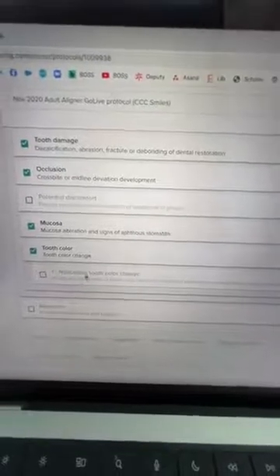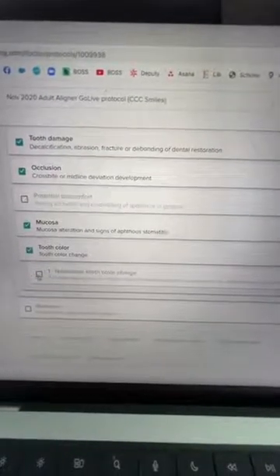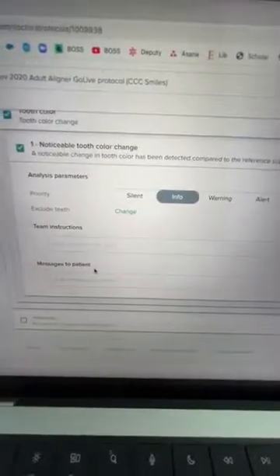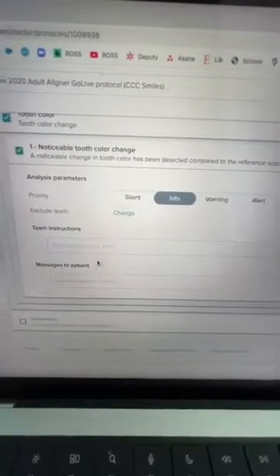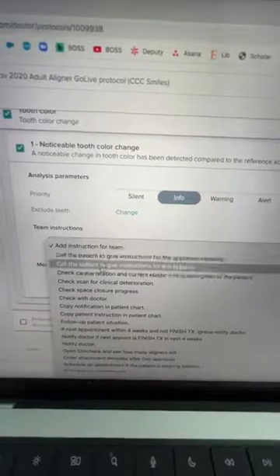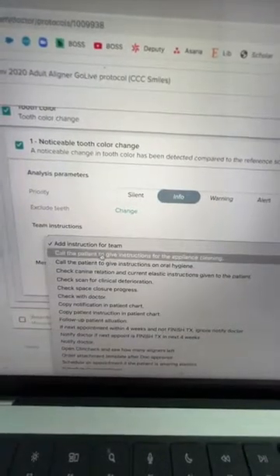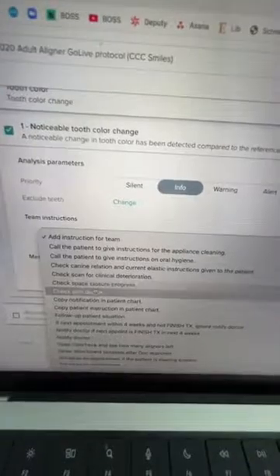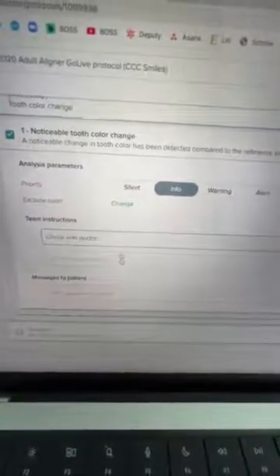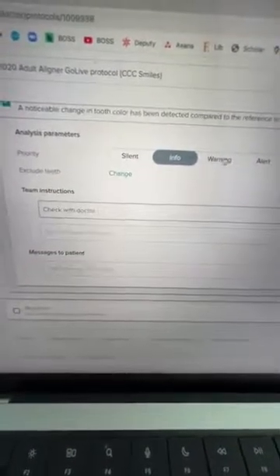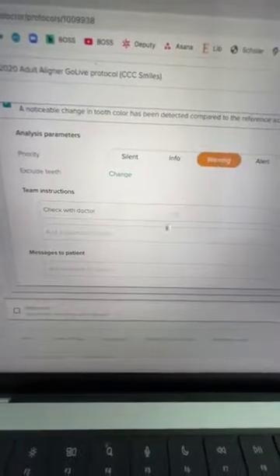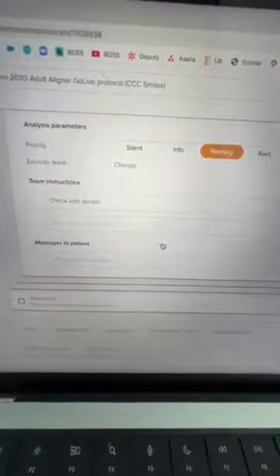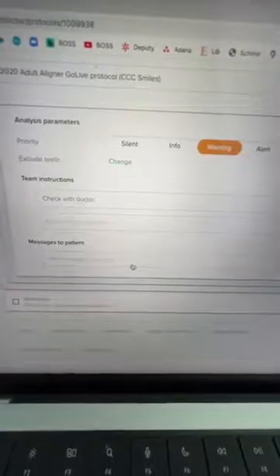For those who suspect endodontics might be needed on a certain tooth during treatment, you can ask dental monitoring to notify you if there was a noticeable tooth color change at any scan. Then I can tell my team: call the patient, give instruction on oral hygiene, or check with doctor. I want the team - let's do a warning here.